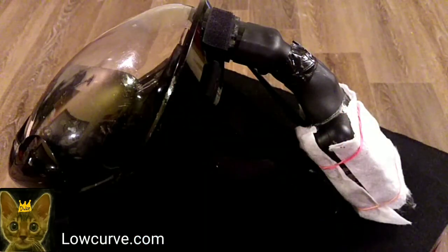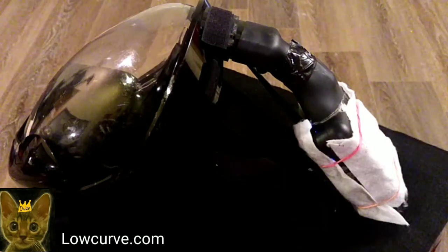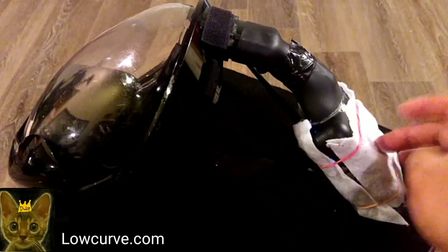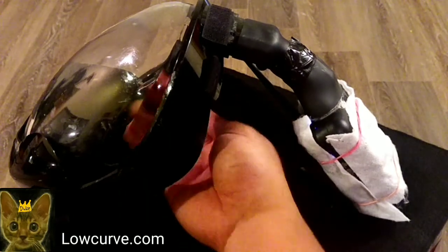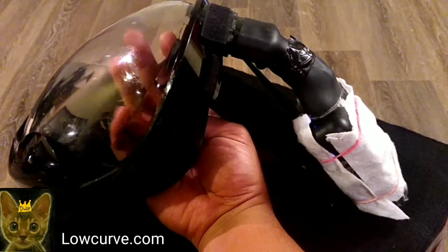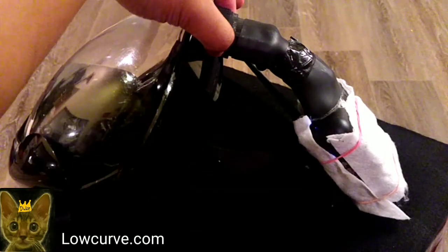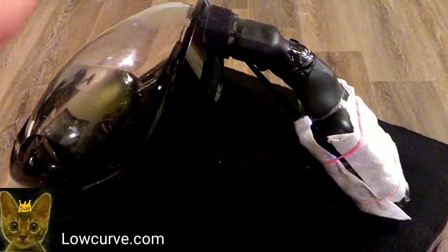So this allows you to filter the air that comes through the mask. The air goes through here, it filters through the filter material, it goes through the piping, and in through here where I feel a nice breeze on my fingers. Okay, so let me just kind of go over how it's done. This is how I figured it out after a while, after lots of testing, obviously.